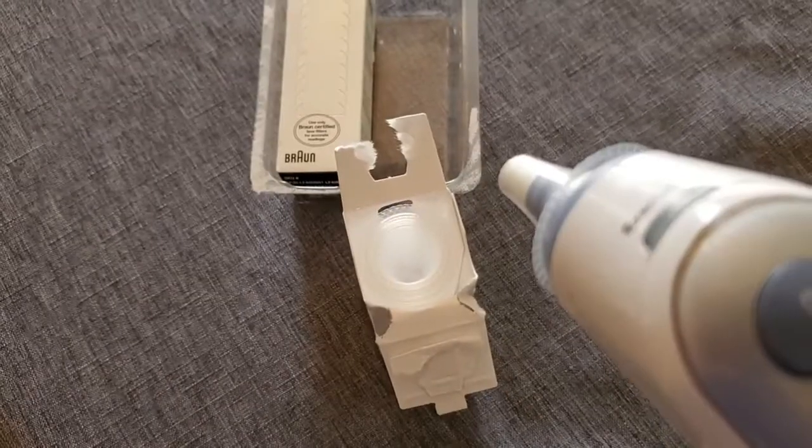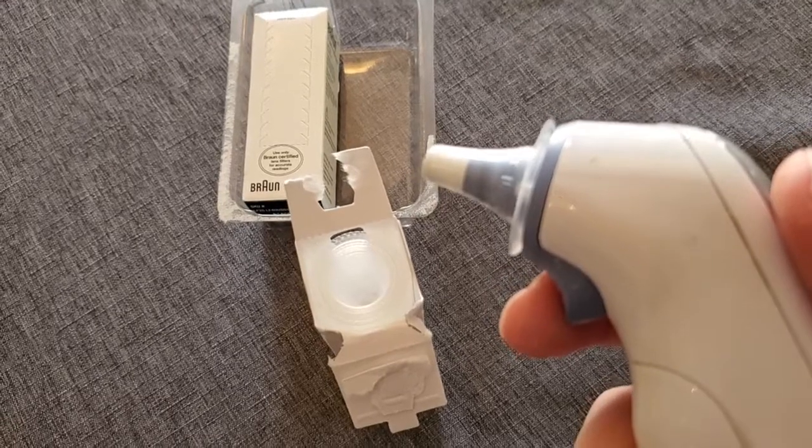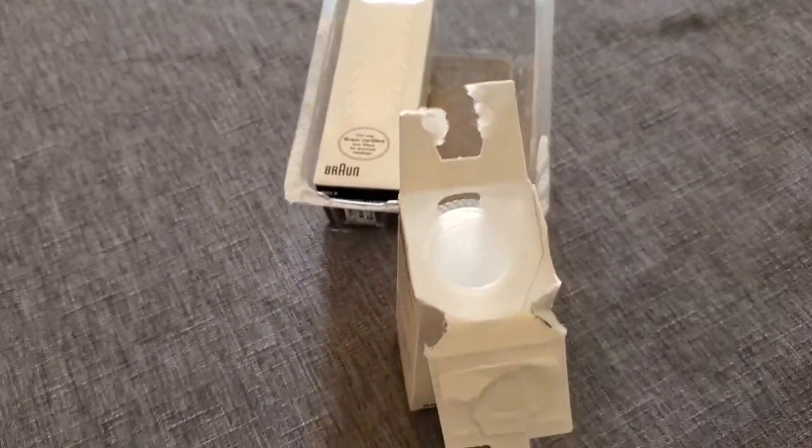That's covered up. You can use this to take a temperature reading, and then when you're done, you're just going to press that button to eject it, throw that away, and the next time you want to use it, you can just press it in and get another probe cover.